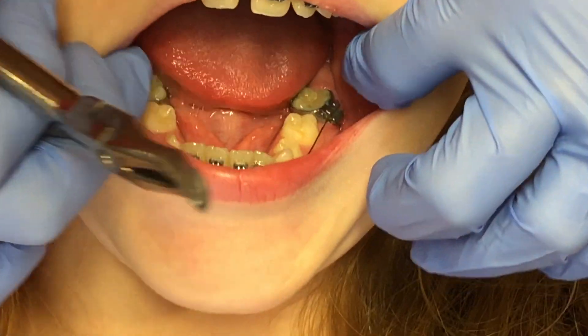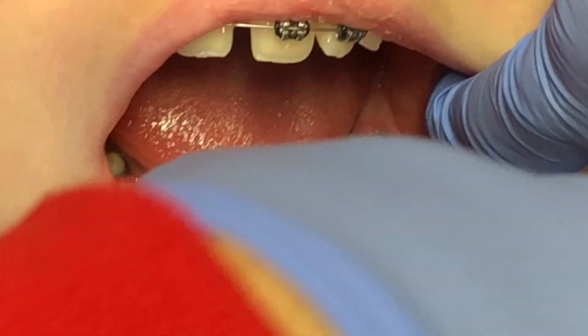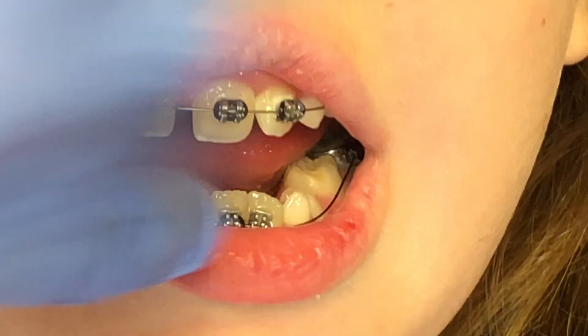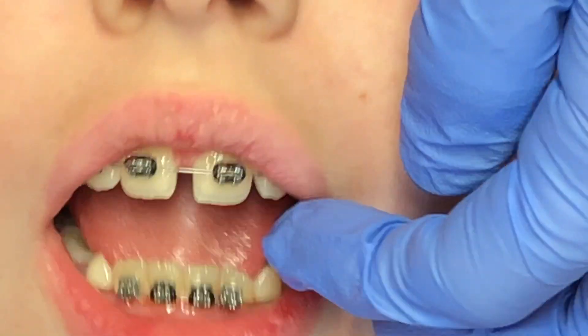At that time I'll put a note to see if we can make this wire thicker, and that way she won't have trouble with this. If she's eating something and this gets pushed, it can pull out the back. I'm going to do another cinch on it, but it could happen again if she eats something hard in those little areas. It just came out — it didn't break though. It just came out of that tube.